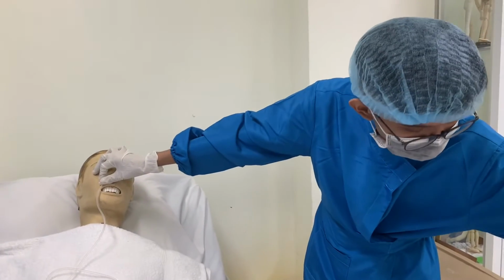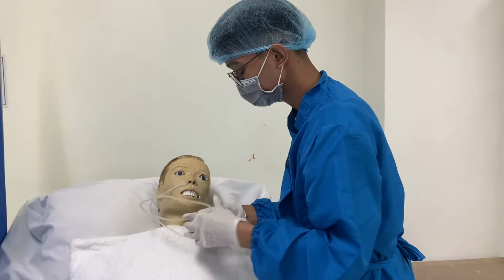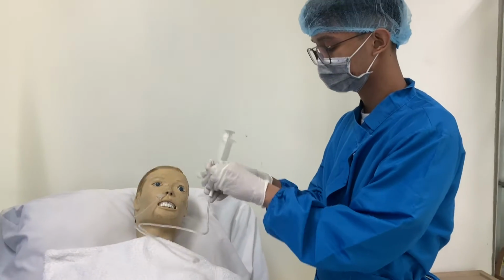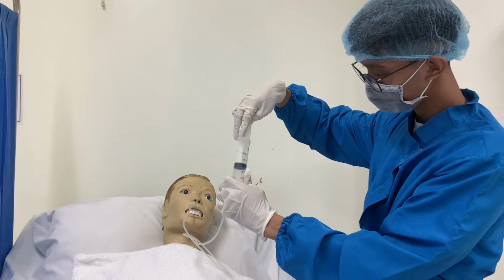Secure the tube loosely to the nose and cheek until it is determined that the tube is in the patient's stomach. Attach a syringe to the end of the tube and aspirate a small amount of stomach contents. Measure the pH of the aspirated fluid using pH paper or a meter.